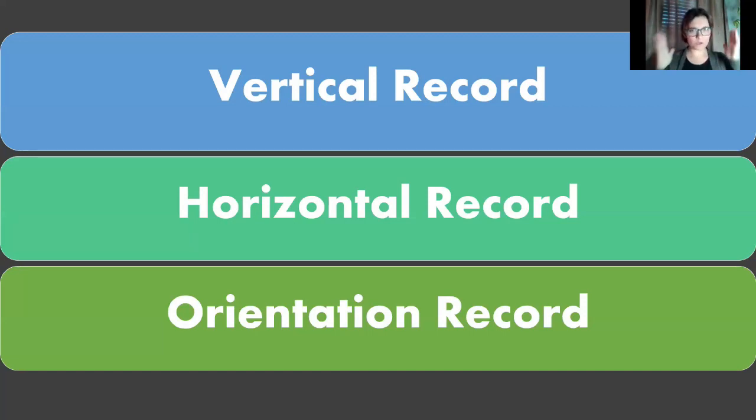Taking a full face photo with a patient looking straight on will allow you, the clinician, or the technician you're partnering with, or a combination of both, to do what's called a digital face bow. So you can take that photograph and actually pull it into the denture design software so that you can orient the patient's face and the patient scans together and establish a more appropriate occlusal plane.